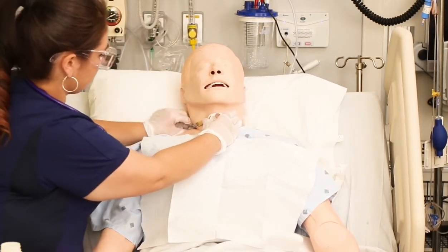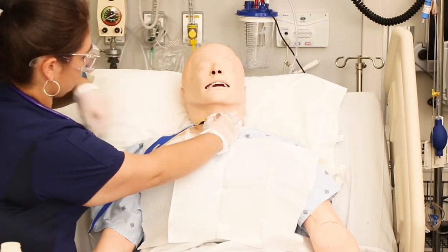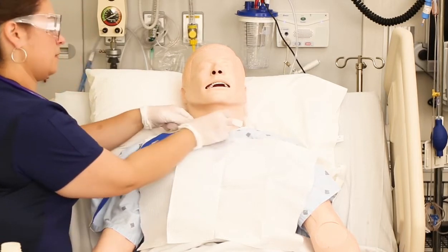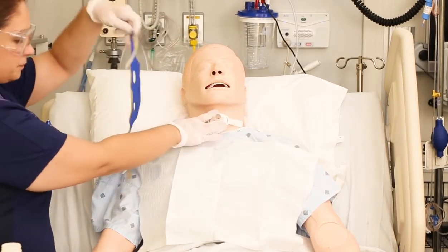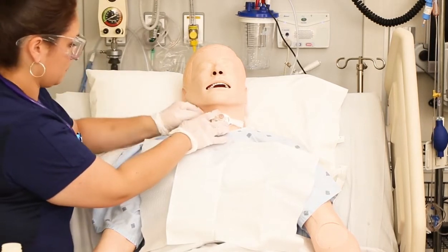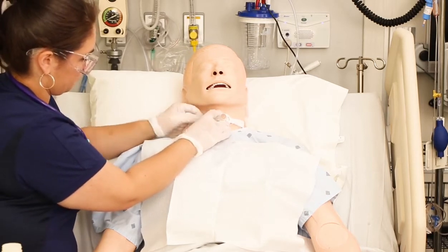So now you've pulled the old ones out and the new ones across. And now you can remove the old ties from the other flange and secure the new ties to that side. The big thing here is just make sure that your ties are not twisted. Any twists in those ties can cause pressure ulcers in the back of the neck or the side of the neck.